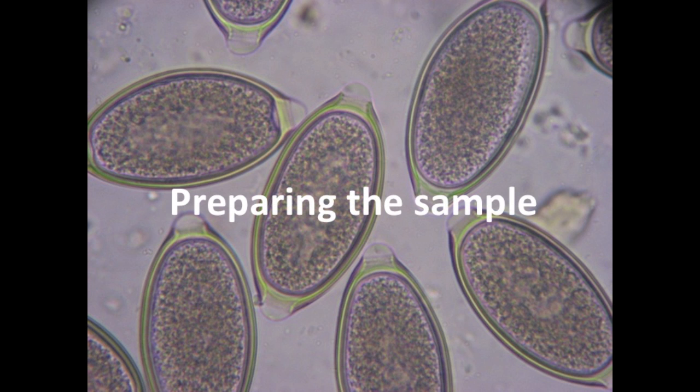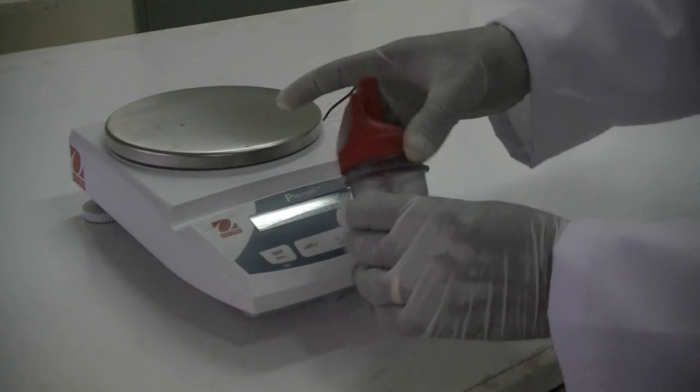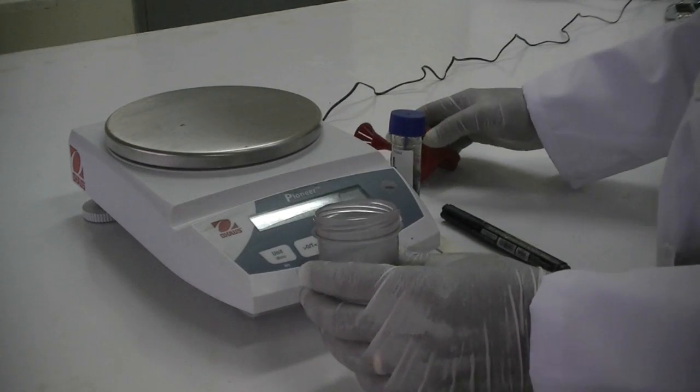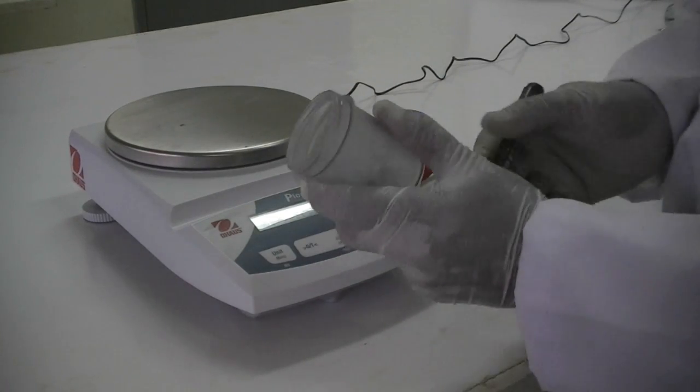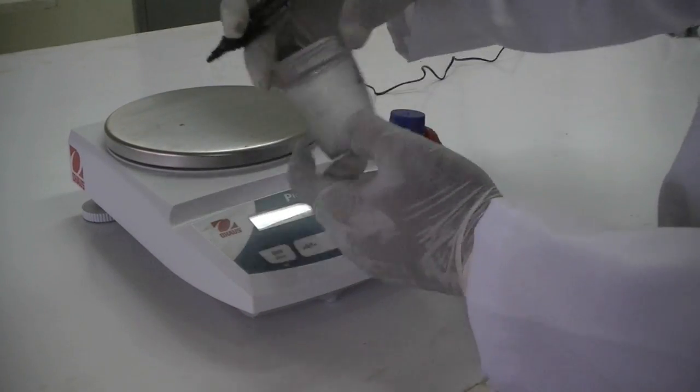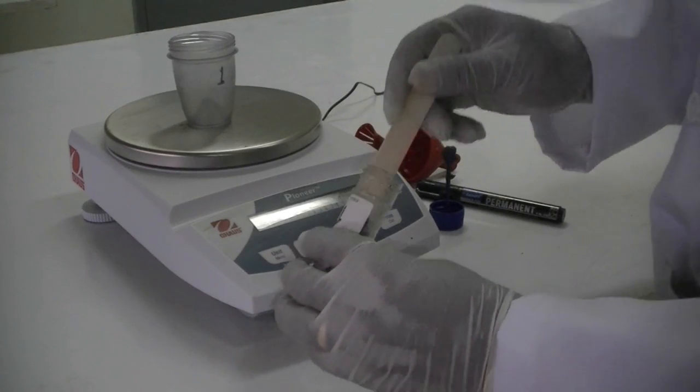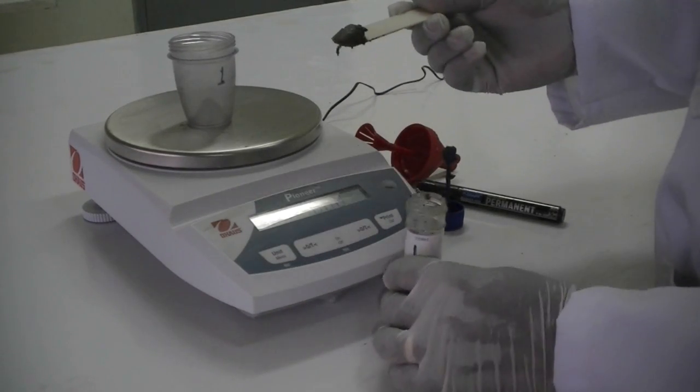Preparing the sample. First, take a clean fill FLOTAC and open it. Label the fill FLOTAC and place it on the scale. Press the tare key and add exactly 2 grams of stool with a wooden tongue depressor.